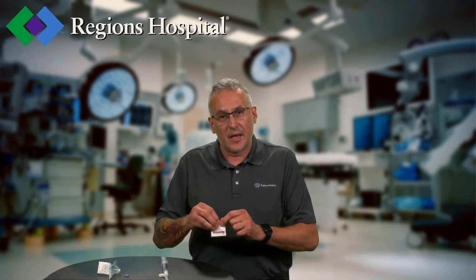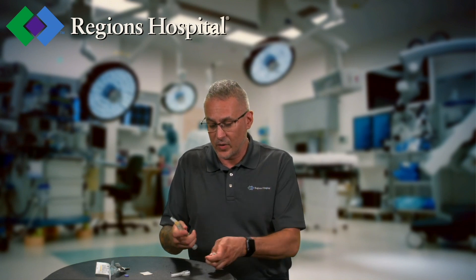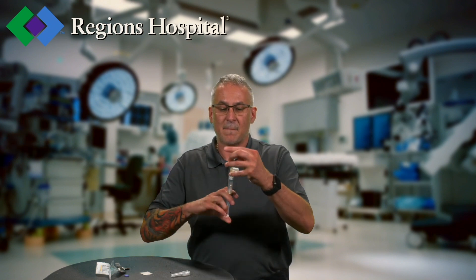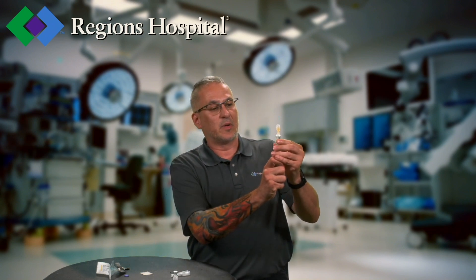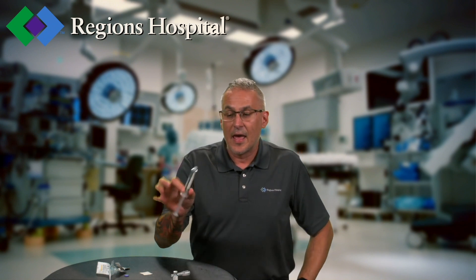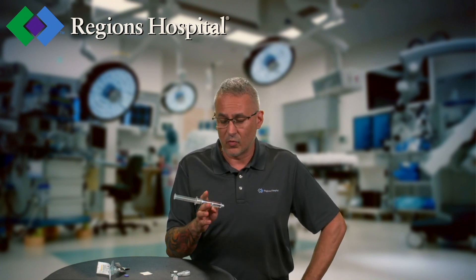Then we're going to take our epinephrine 1 to 1,000, take an alcohol wipe and get a quick wipe. Then we can inject one cc of air in there so we get a nice easy draw. Draw out that 1 to 1,000 epinephrine, get rid of the little bit of air left, and go ahead and secure our sharp — or if you have a safe needle, disengage it. Now I've got a syringe of 1 to 10,000 concentration epinephrine for use.